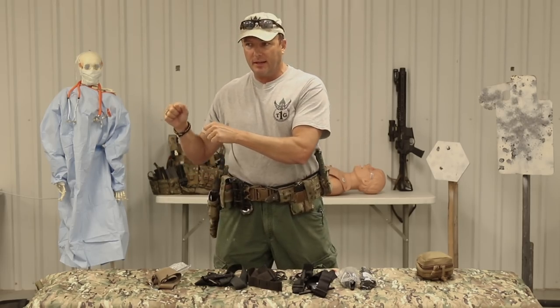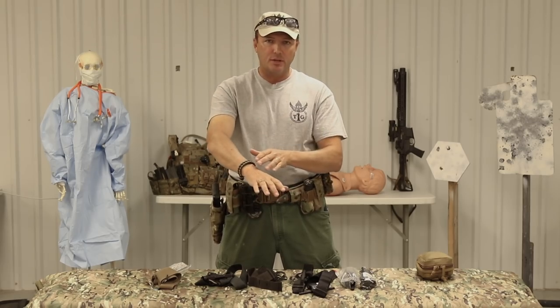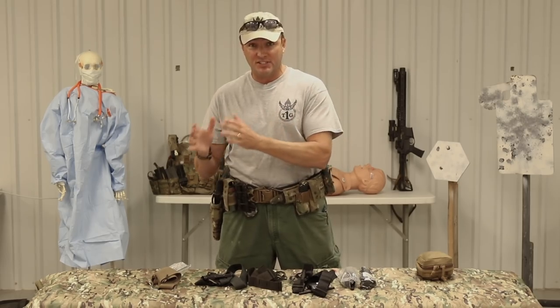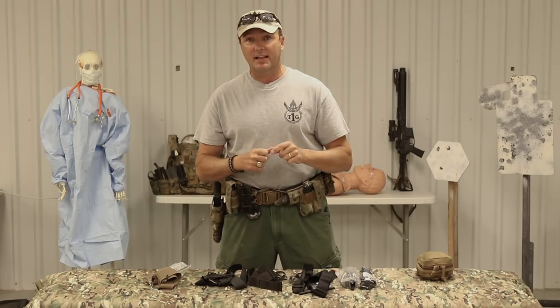Once you've got them in a good covered and concealed location - inside a local store, in a vehicle, or a helicopter hauling tail away - that's now tactical field care. You've got a little more time. You want to put it three inches above the wound and get the uniform off of it. Expose the patient as part of tactical field care. Put it three inches above the injury, clamp it down, and turn it until the bleeding stops. The whole point of tourniquets is not about being a gear dude with something sexy on your kit - this is life-saving equipment. You've got to get it on quick and use it effectively, or it won't keep those red blood cells inside the body. That's what stops shock and saves lives on the battlefield. Get TCCC committee-approved tourniquets onto that casualty as quickly as possible.